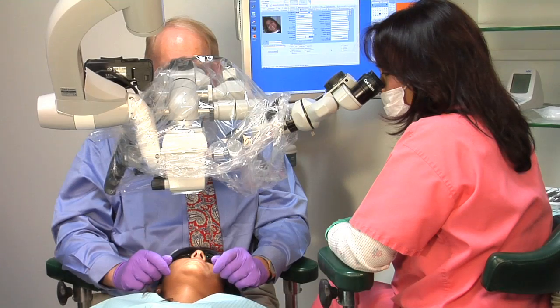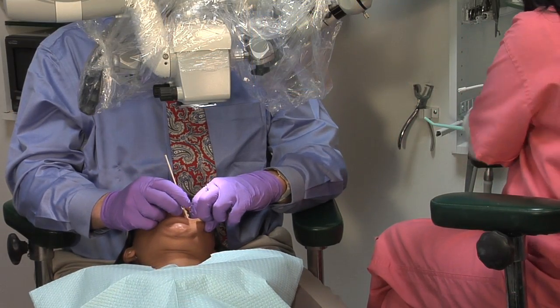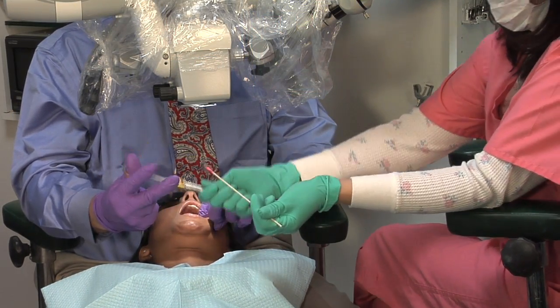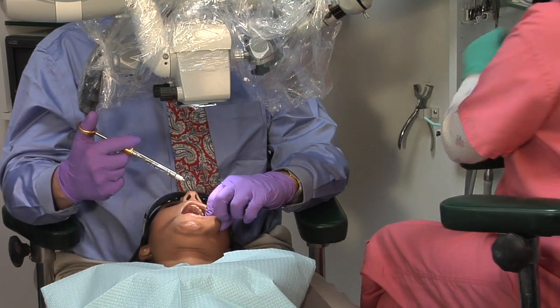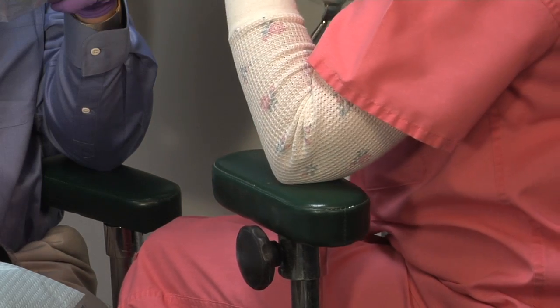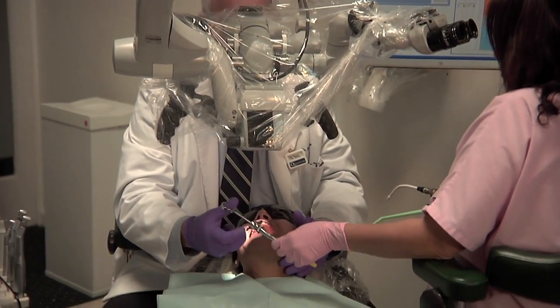Now we'll demonstrate mandibular injections — same procedure. Notice how I'm moving the patient's chair with my knees. This is a left mandibular injection. You have complete visibility while doing this. The secret is the armrest for both the doctor and the assistant.